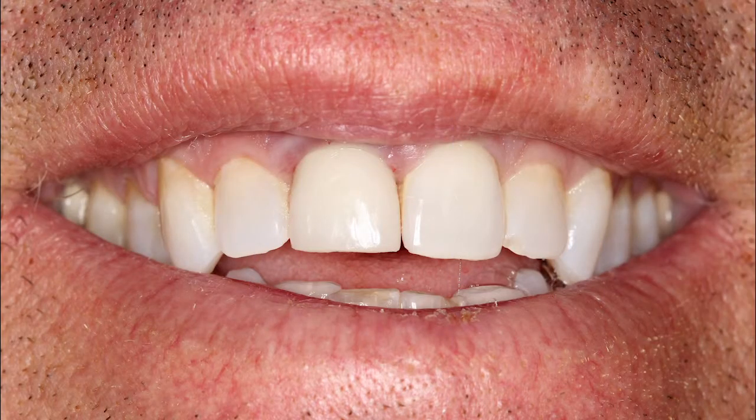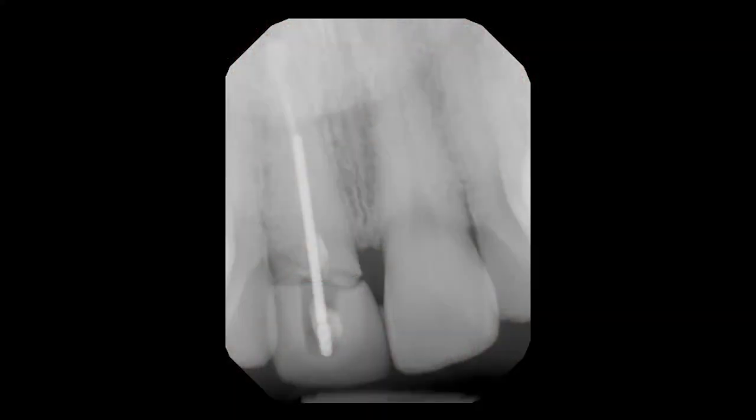In Figure 1, the patient presented with a symptomatic and mobile maxillary right central incisor. The adjacent teeth were unrestored. In Figure 2, you can see that the radiograph illustrates a horizontal fracture in the maxillary right central incisor.